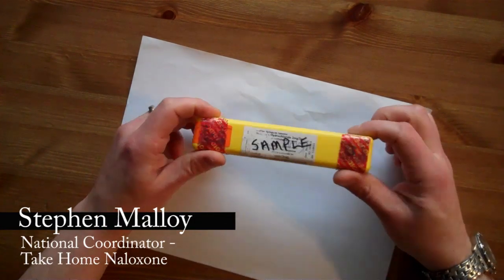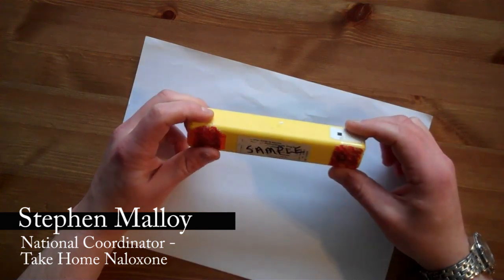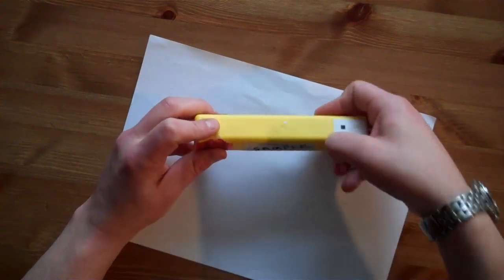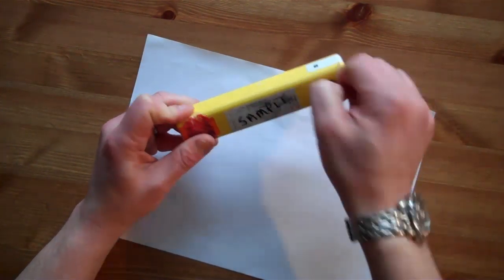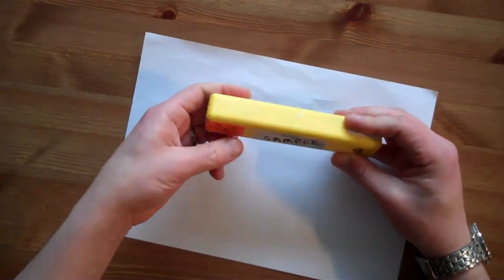Okay, so this is a sample naloxone kit. First thing we have to do is remove the red security seals from each end of the box.